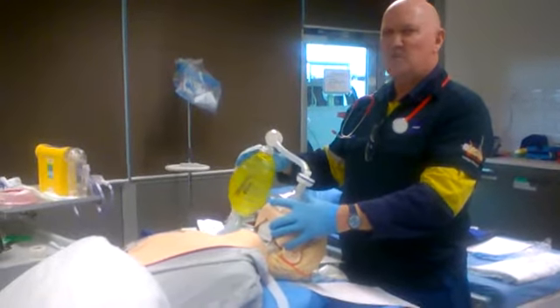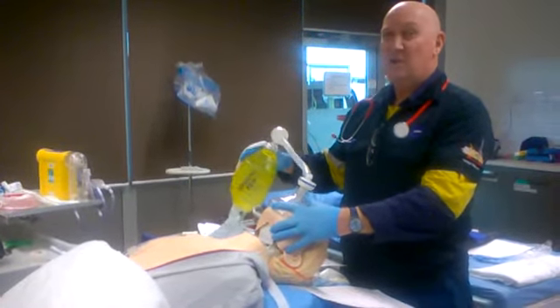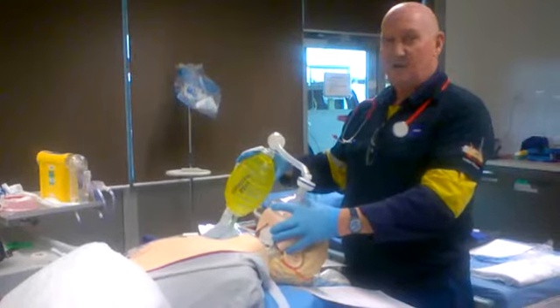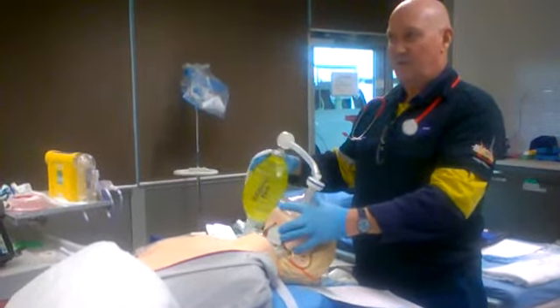Now with sux, onset is quick, but it has a lot of contraindications. So beware of these contraindications, but you've got a duration of 6 minutes. All right, so we've given the sux, administered nice and slow. So we bag the patient up. Laryngoscope, light has been working. So we go down the mouth in the sniffing position, sweep the tongue across, just advance it down and lift up. Not against the teeth, lift to the corner of the room.